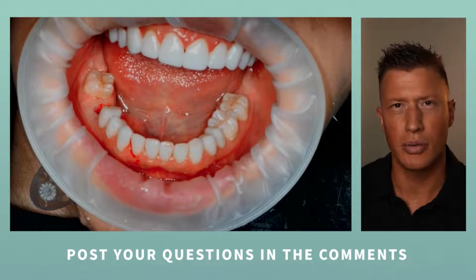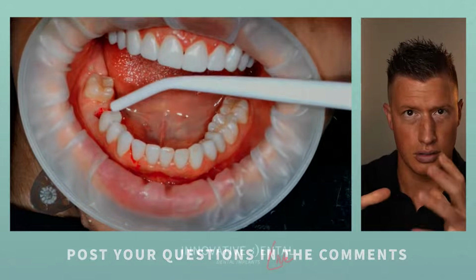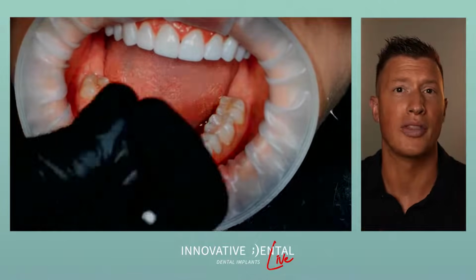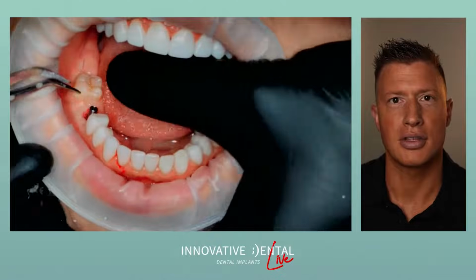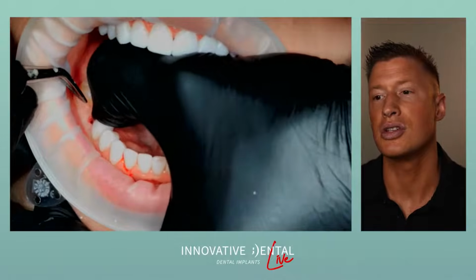With this approach, we are designing in software and 3D imaging, we're designing your future crown and then figuring out how we can best place the dental implant to work with that crown. So that's what we did here, and we get an optimal result. Obviously we want all of our patients to have successful implants and have very little issues with them.